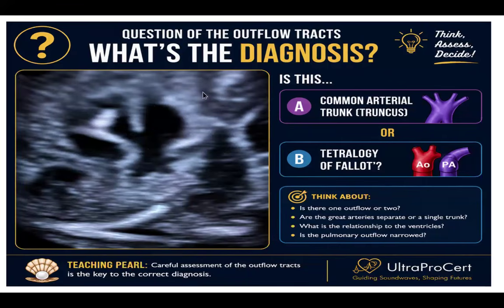But you see, when I scanned this patient and went to the outflows view and saw this, I knew right away, because it's classic to that textbook picture that we saw earlier.